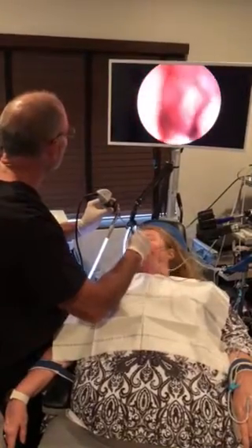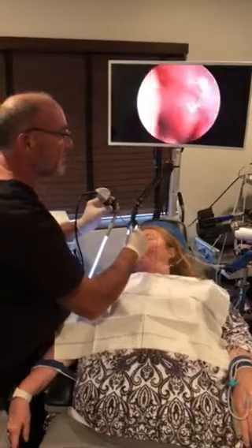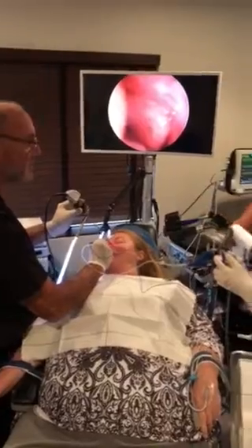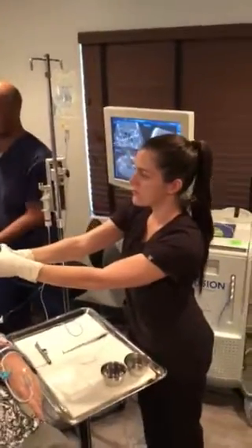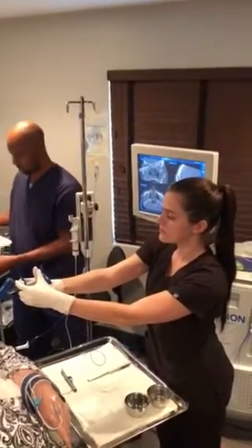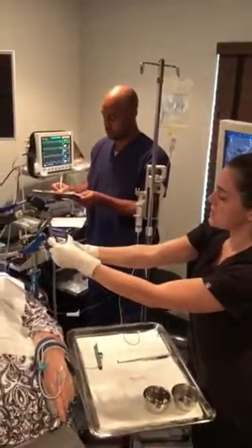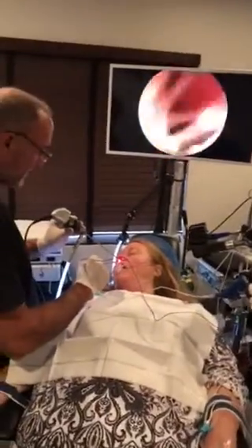Now we're going to the back of our nose, and the CT is very helpful here in guiding us into her sphenoid sinus, right there. Inflate. Inflate. Deflate. Deflate. Inflate. Inflate. Deflate. Okay, let's go to the other side.